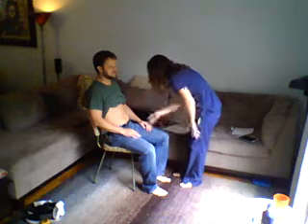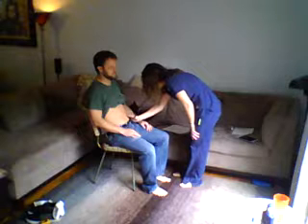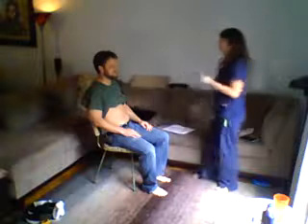Okay. Now I'm just going to take a listen to your belly. I'm going to start just by inspecting it. Okay. No signs of hernias or any pulsations. Any tenderness? Nope. Okay. It's soft, non-distended, non-tender. I'm just going to listen to your bowel sounds in all 4 quadrants. Got chili for lunch. Good. Bowel sounds are present in all 4 quadrants.